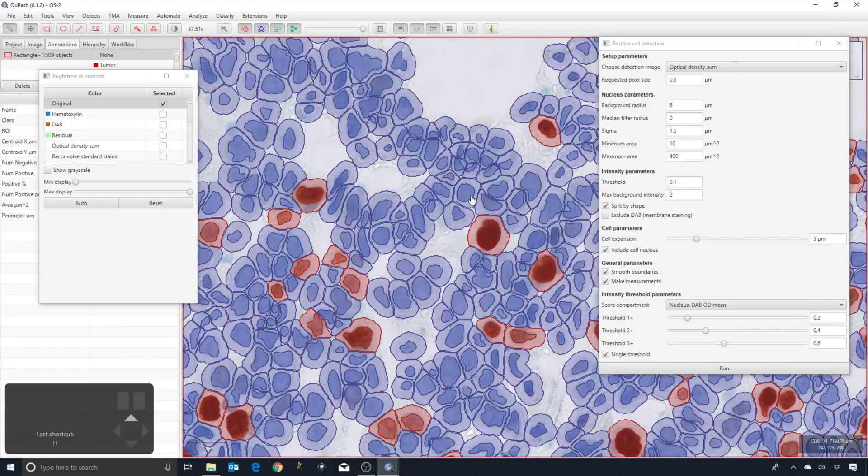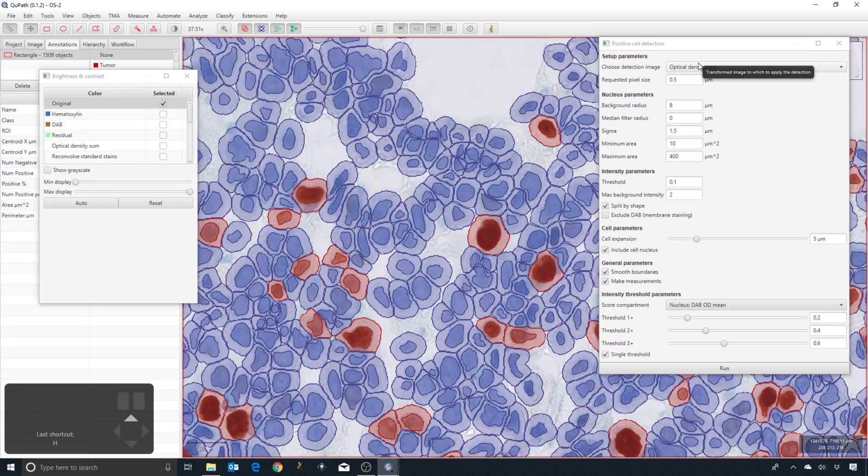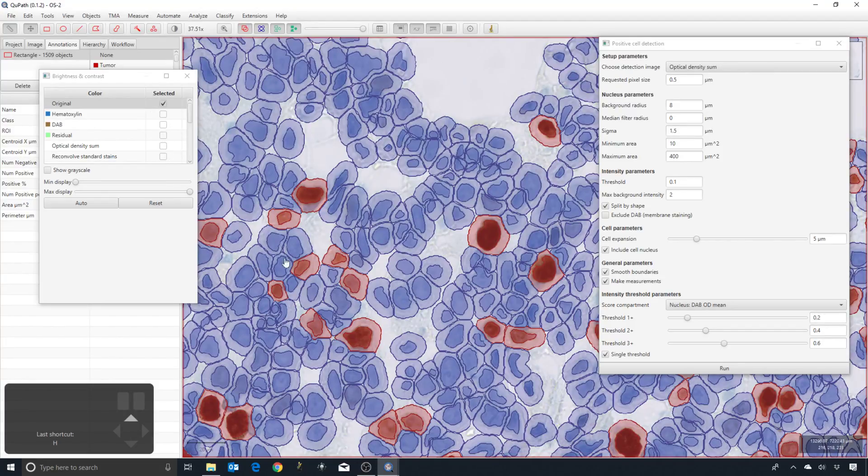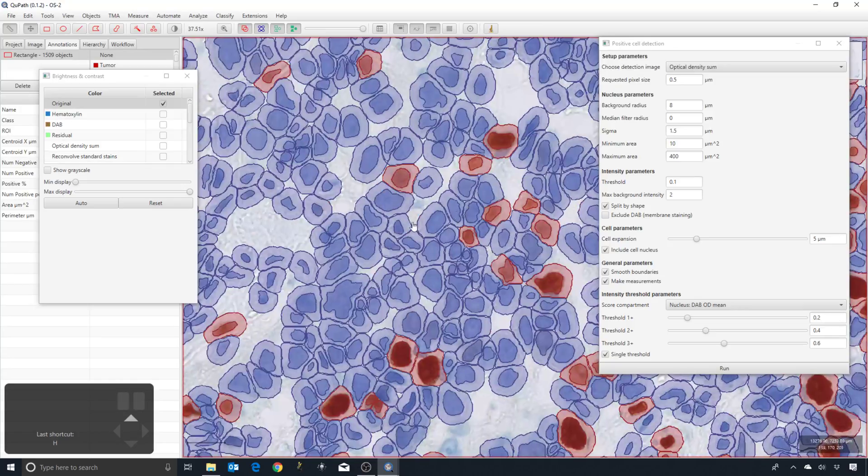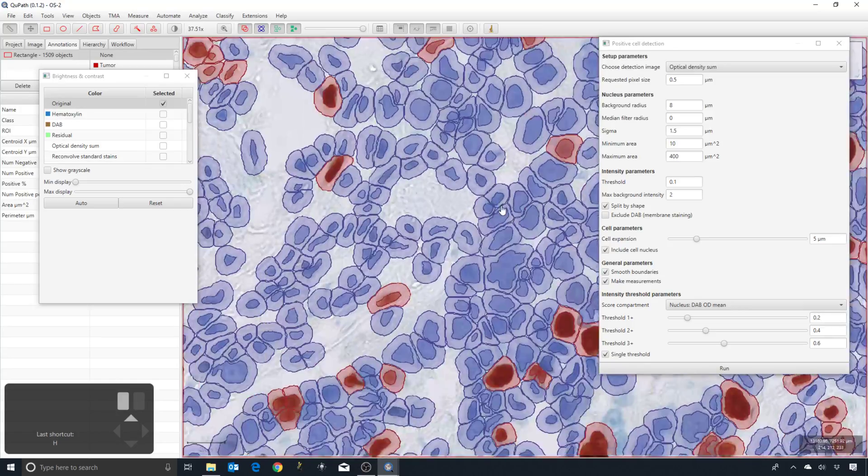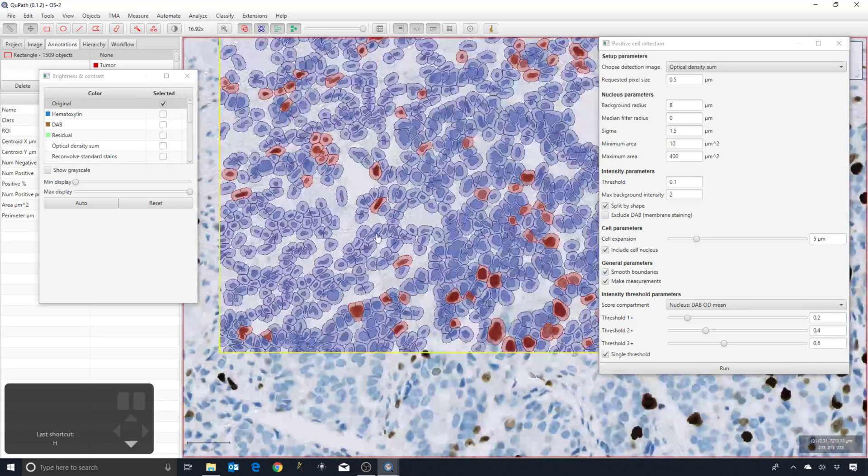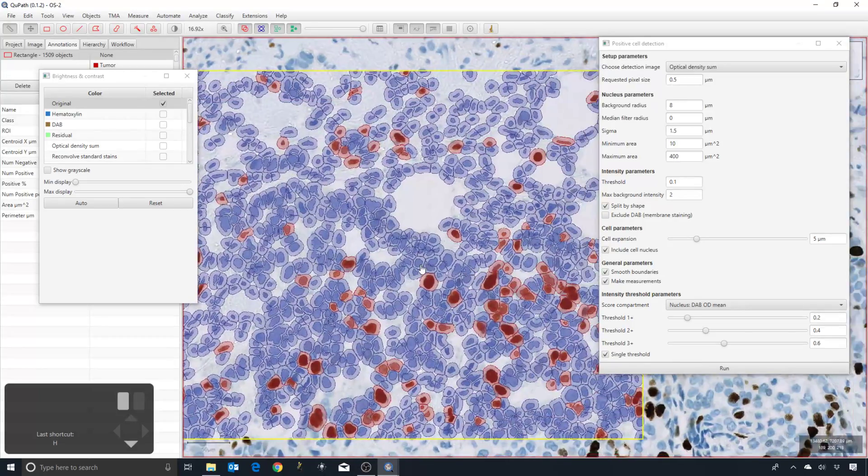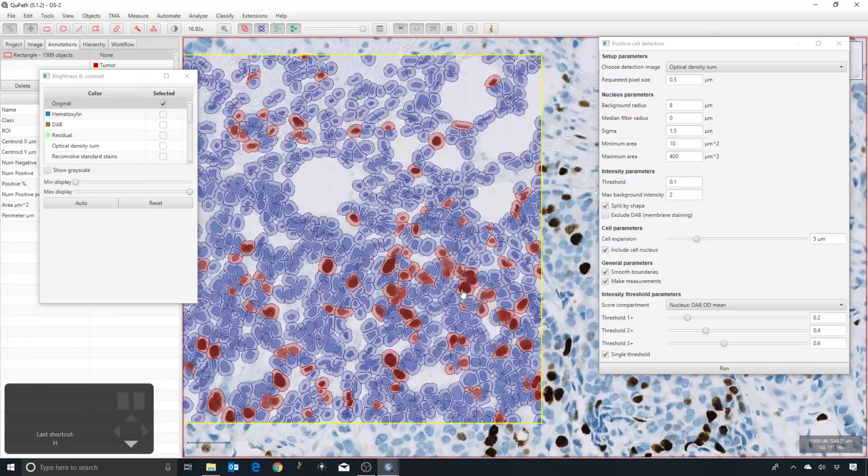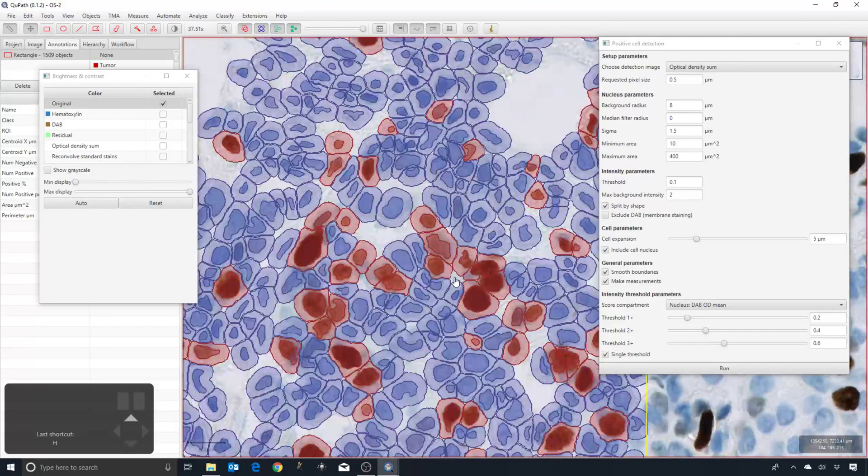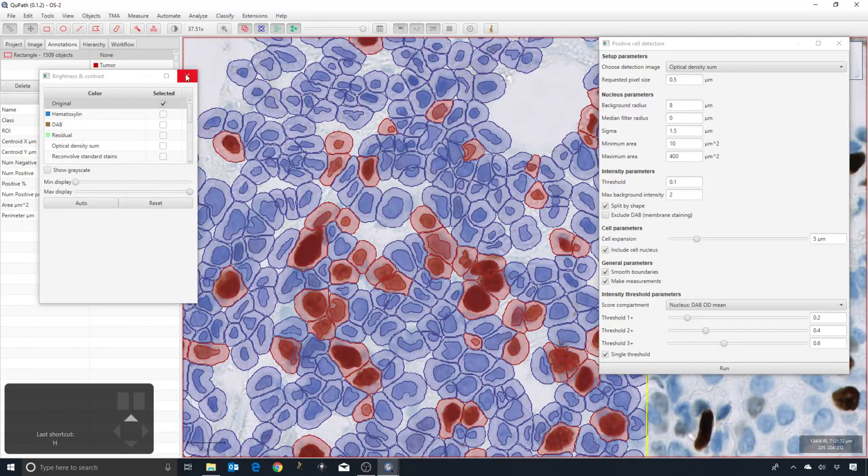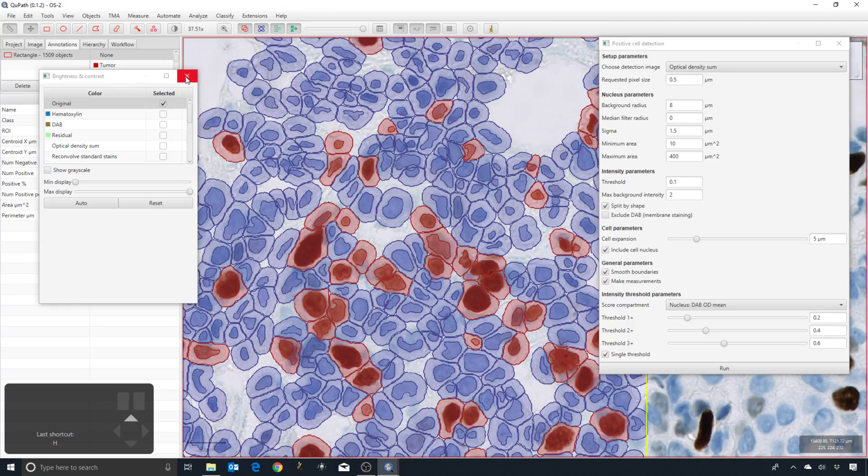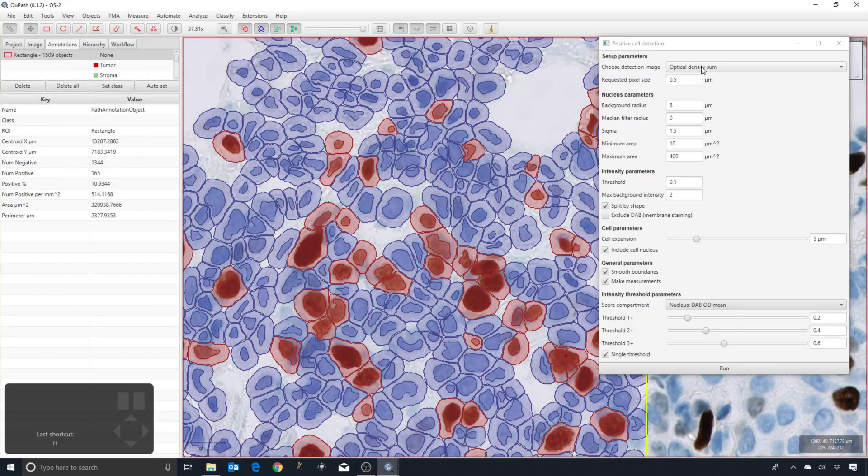It's not necessarily the case that optical density sum will give the best results in every image, but now you can go in, look at the color transforms, and get an idea of what might be the most appropriate image to apply your detection to. So I'm going to leave it at optical density sum and then start to move down a bit further.